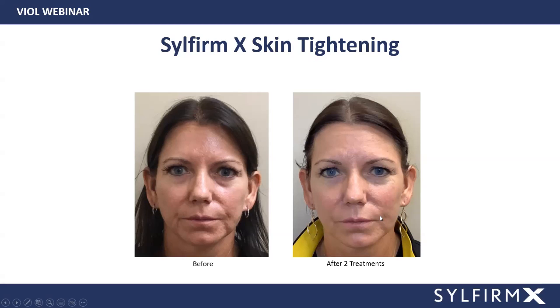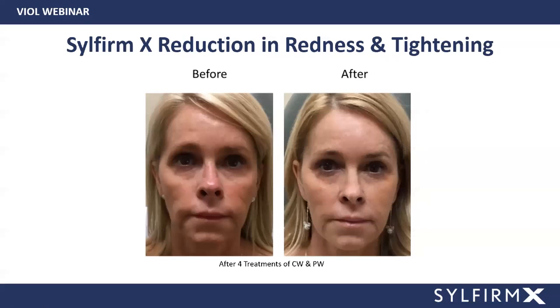And that's with just 2 treatments. This is another patient who has severe sun damage. So we combined continuous wave and pulsed wave. We did 2 treatments of each, 4 treatments total. And if you look at her forehead area, we're able to reduce the pigment that she has in the skin.